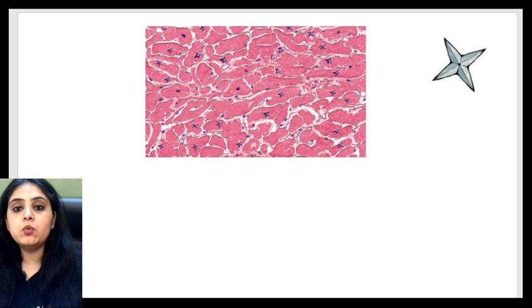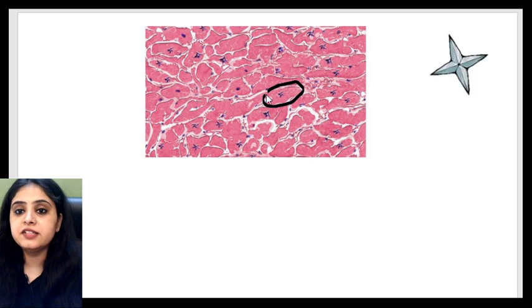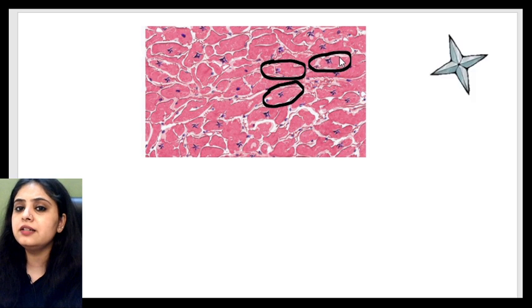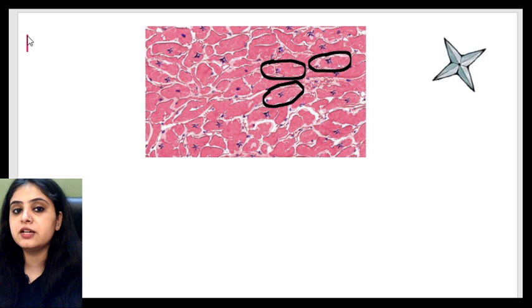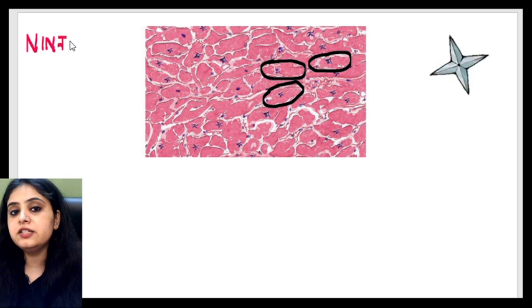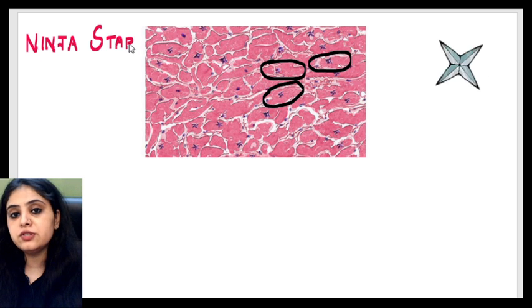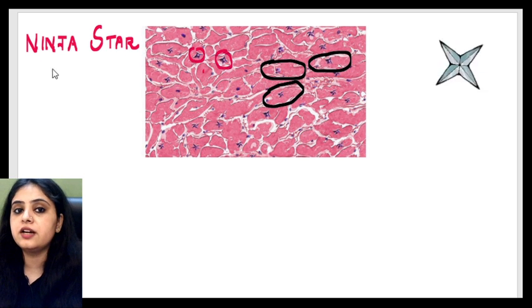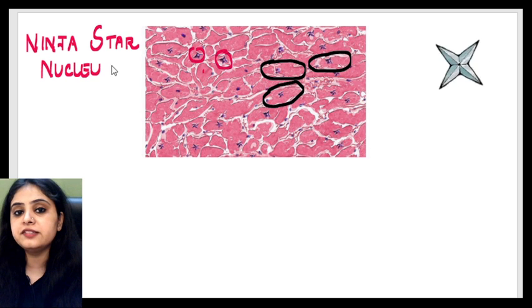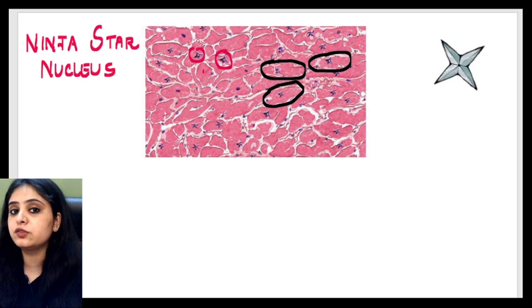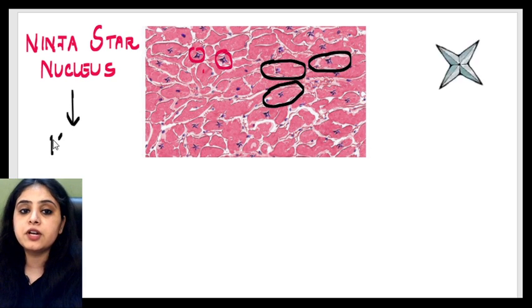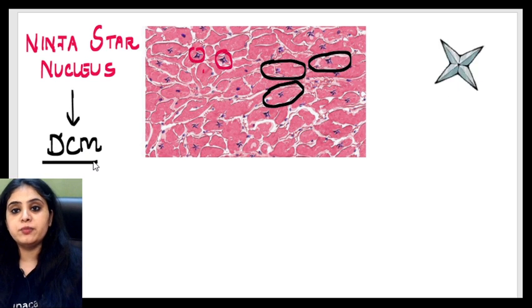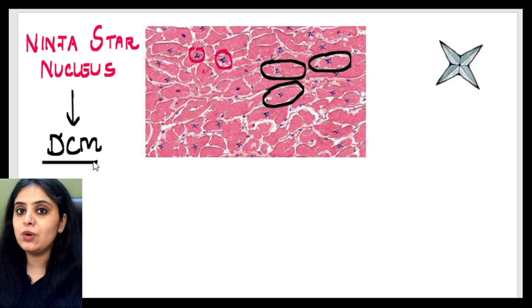This is image number one, where you can see cardiac fibers. Inside these cardiac fibers, the nuclei have a slightly different morphology. And what is that morphology? With the GIF shown here, this is the ninja star nucleus. If I highlight the nucleus, you can see it right here. This ninja star nucleus is seen in a type of cardiomyopathy — specifically, dilated cardiomyopathy.